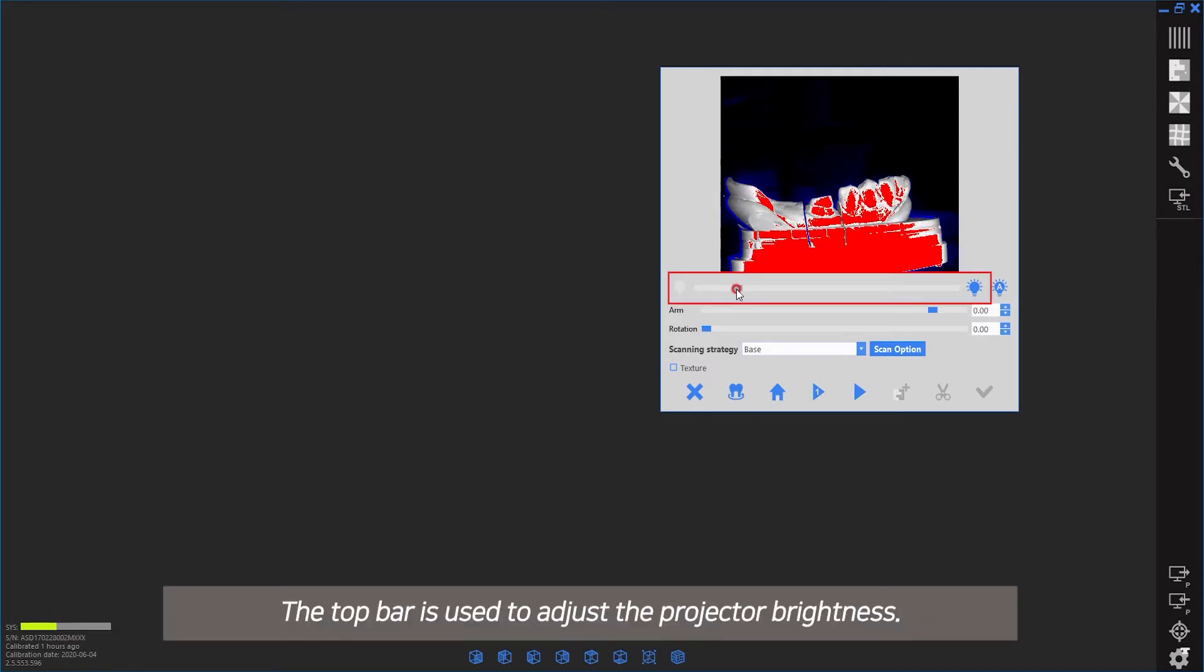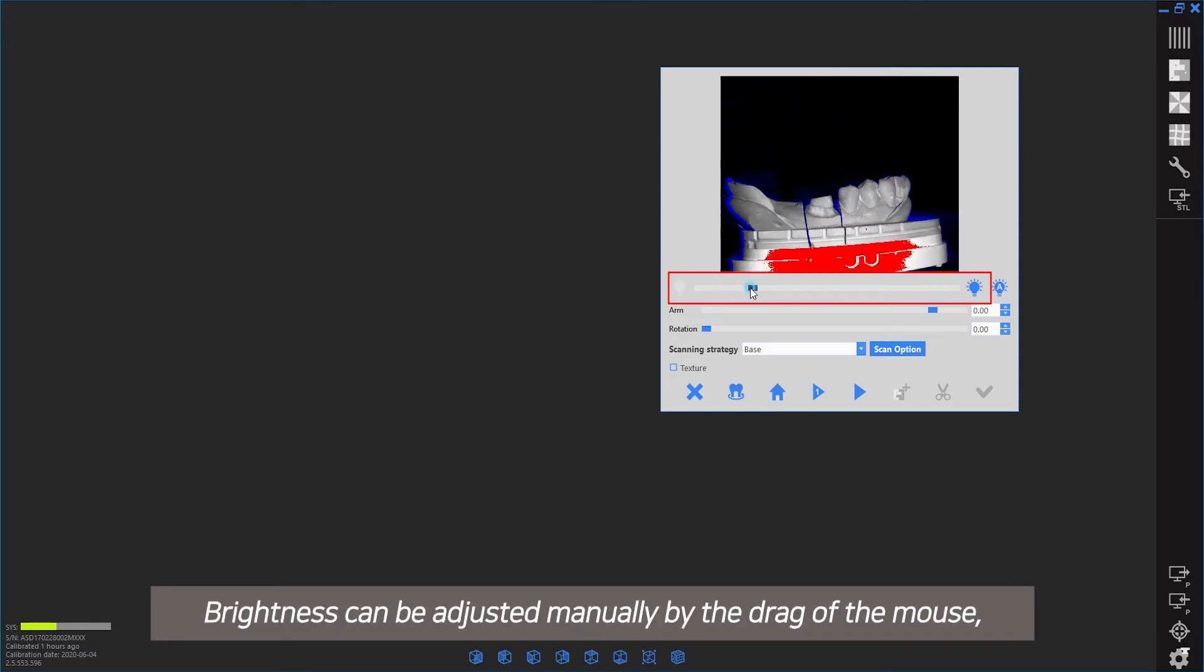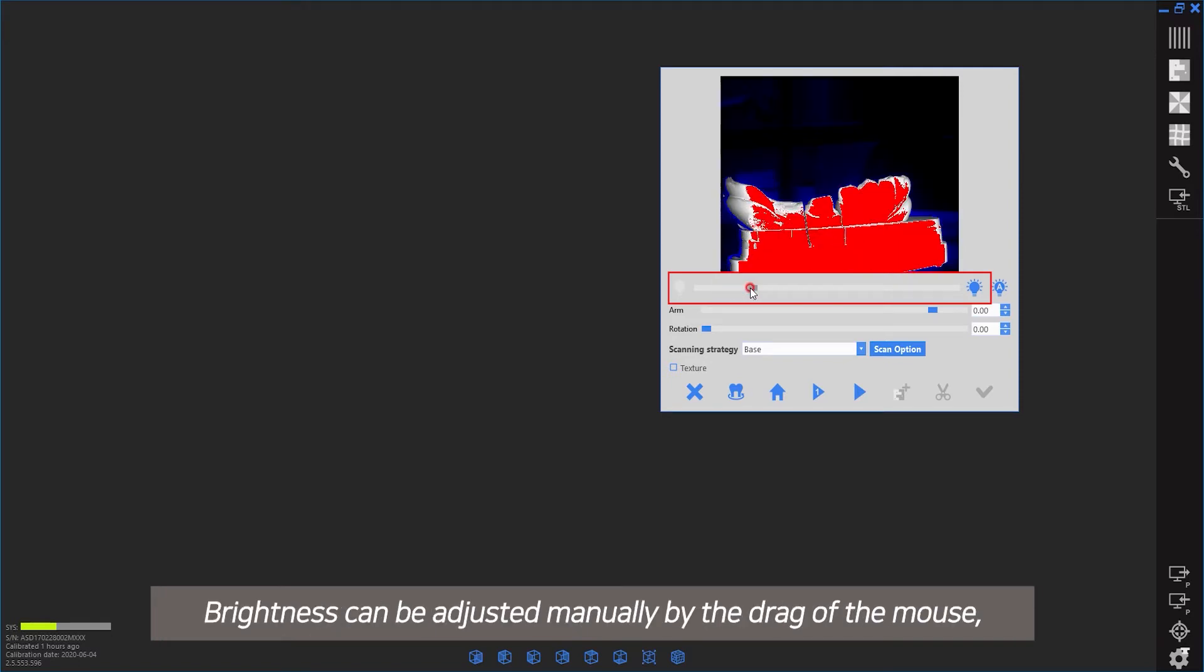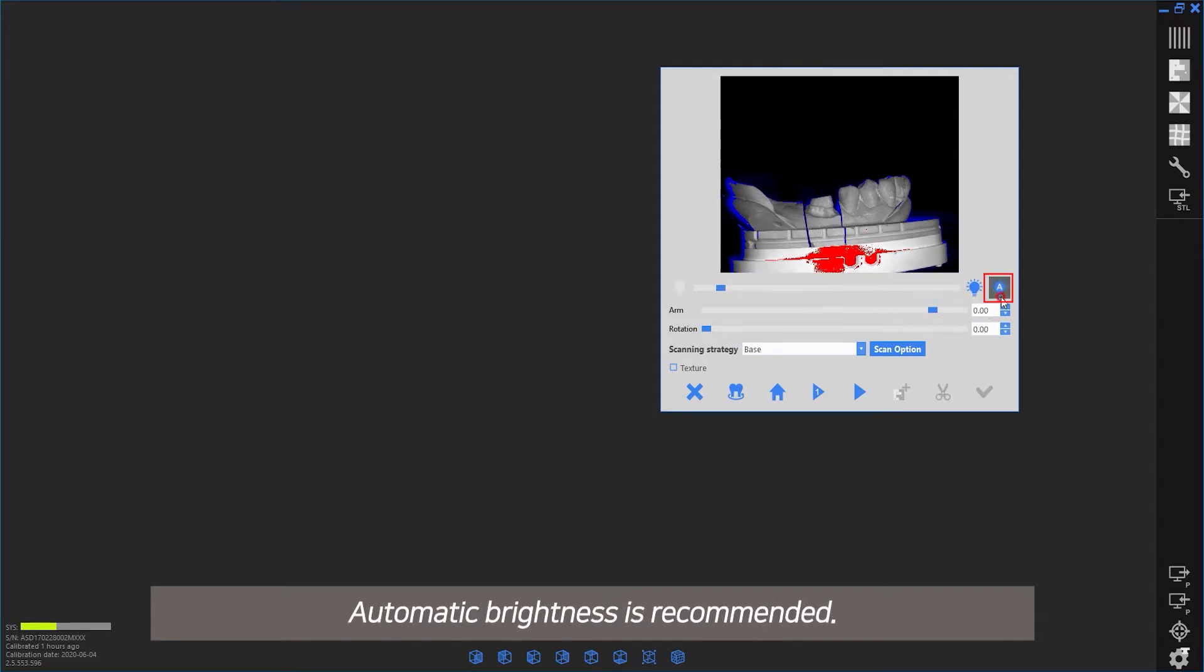The top bar is used to adjust the projector brightness. Brightness can be adjusted manually by dragging the mouse or by using the icon on the right. Automatic brightness is recommended.